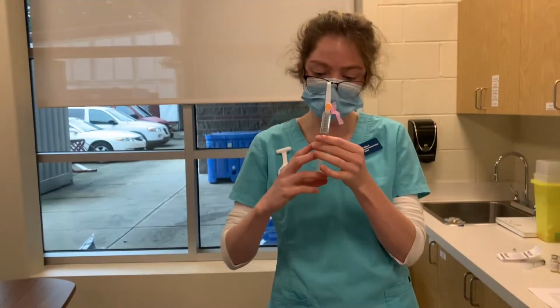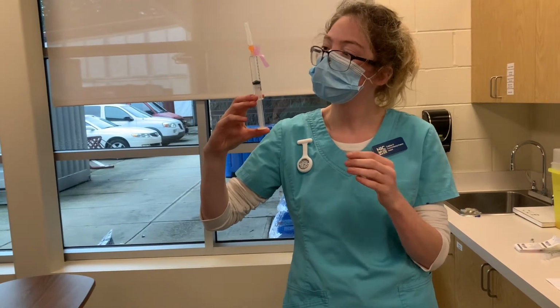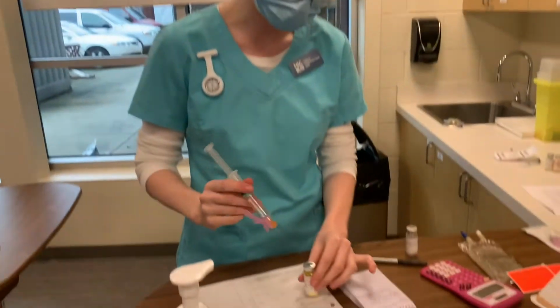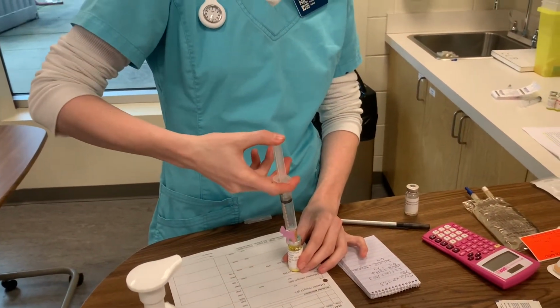There are a couple air bubbles, and now it is perfectly at 8 mils. I'm going to inject it into the medication.